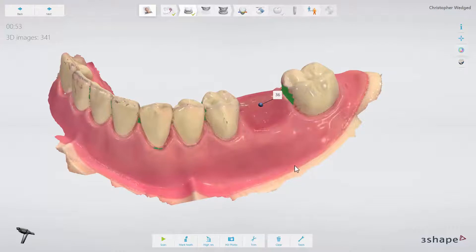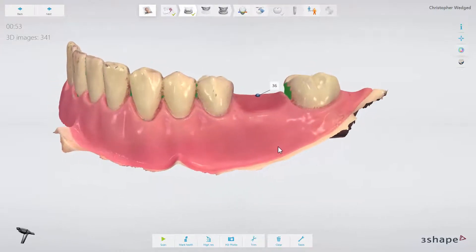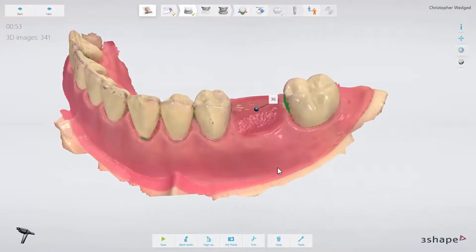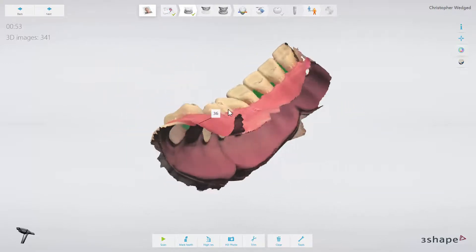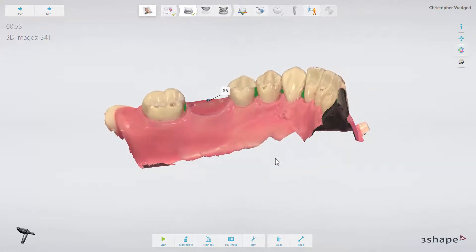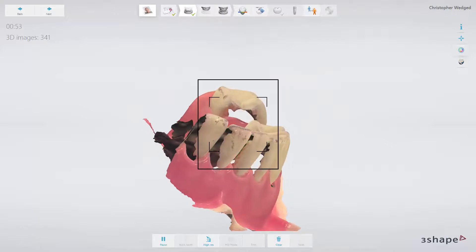Now we have a digital model with enough height on which to stabilize the guide. We also have a good view of the soft tissue, which is important to get a good understanding of the surrounding areas. Please note that for a successful and predictable outcome, it is imperative that the implant site and the surrounding areas are fully covered by the scan. If needed, go back and cover the missing areas.